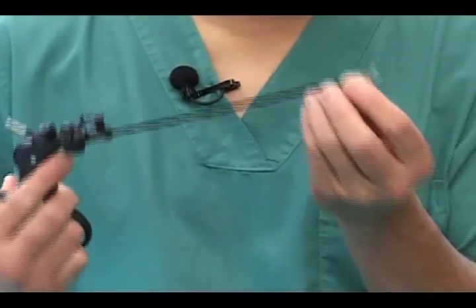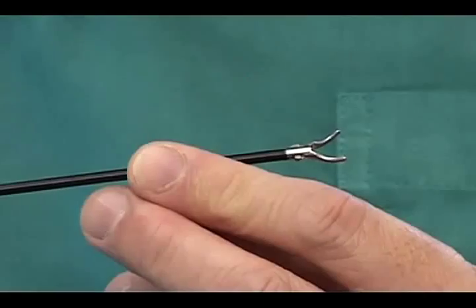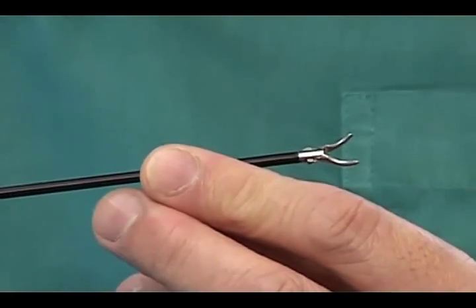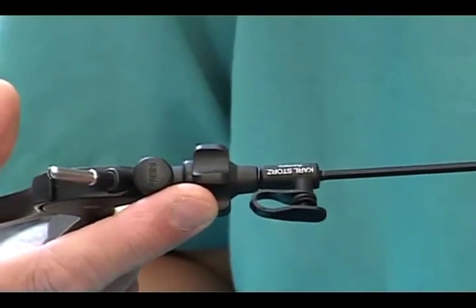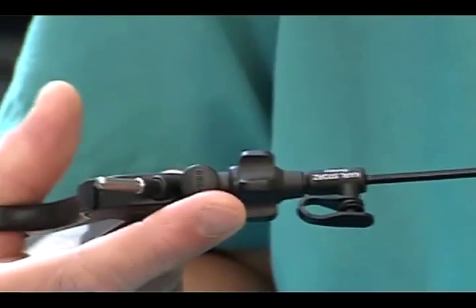This is a 3mm Kelly dissecting and grasping forceps. It has a fine tip on a small curved blade, which allows delicate tissue handling and can be used for very meticulous and fine dissection.